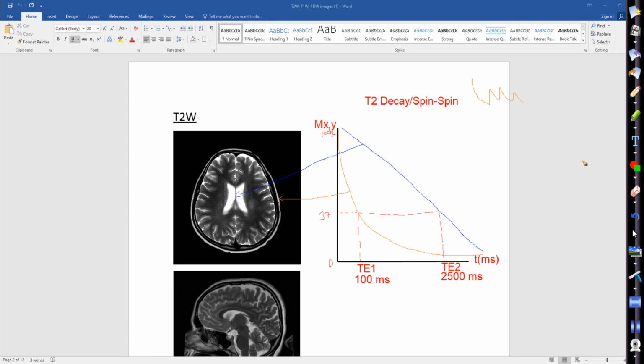Okay, so let's just draw in those curves. I'm kind of guesstimating at this point, so I'm just going to give it a different color. I'm going to code white matter as green. So Savannah was right in saying that since it's darker, and this is white matter, kind of in this area, because it's closer to our ventricles, I'm going to give it a curve.